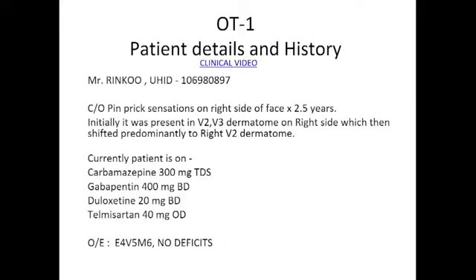Sir, just a question, not actually a question. If you do V2 first and then come back to V3, as Dureja was saying, probably the effect will be there and you will actually appreciate it. Yes, for that you just need to increase the stimulation voltage. So instead of 0.3, because right now we got it at 0.3, if it is not coming again, we give it at 0.5 or 0.7. And also I look for the motor stimulation at this point of time.